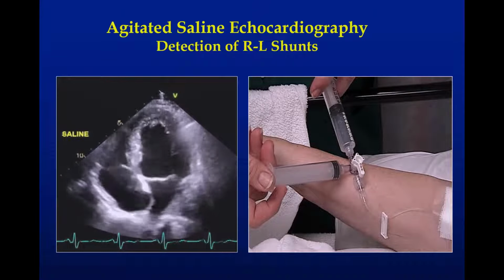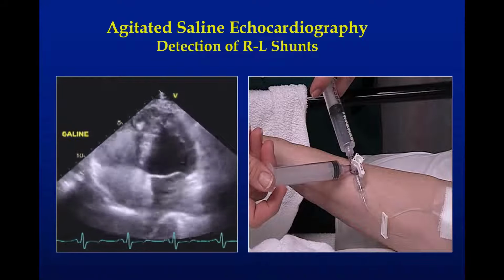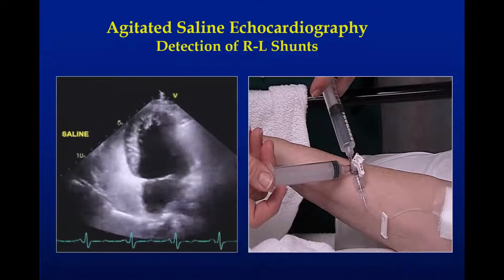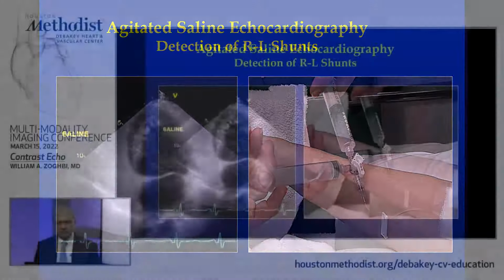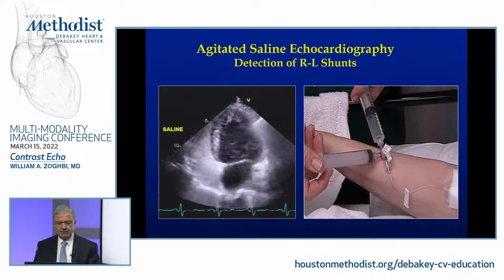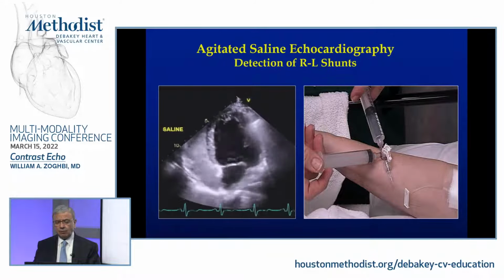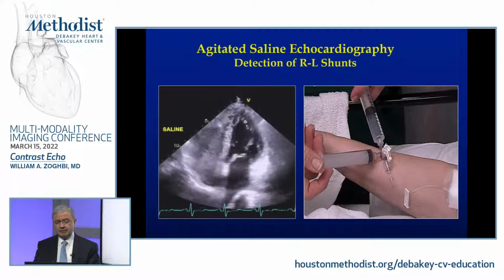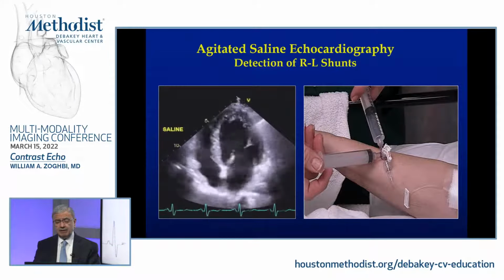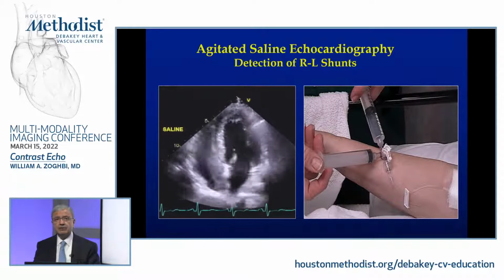We see still some of the issues of diagnosis, differentiation between the two. Remember one thing, just like in this case here, that a PFO is usually episodic, as well as atrial septal defect. The contrast, you'll see that coming episodically, may come early or with Valsalva or otherwise, but at times may come late, depending on when this difference between pressure gradients of the right atrium and the left atrium occur.